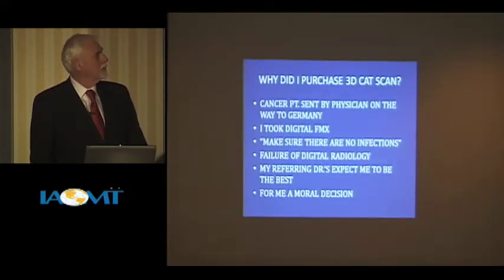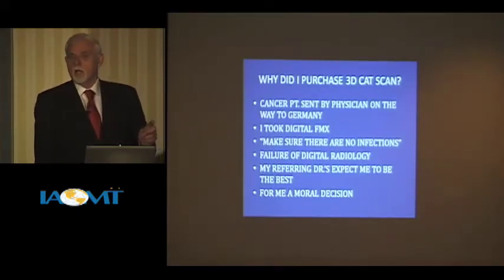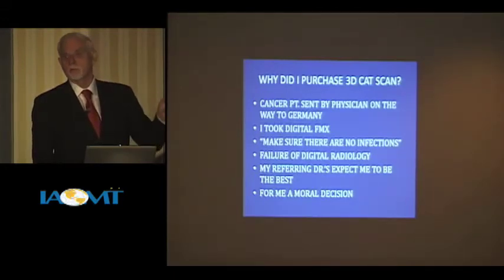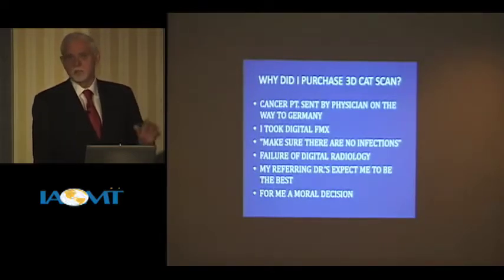Why did I purchase a CAT scan? 2 years ago, in January, a physician sent me a patient with cancer. The patient was on the way to Germany for cancer treatment, and the physician said, make sure there are no infections. State of the art, I thought. So I took full mouth digital x-rays. I looked at a mouthful of PFMs and didn't like that, but didn't see any infections, didn't see that part of it.